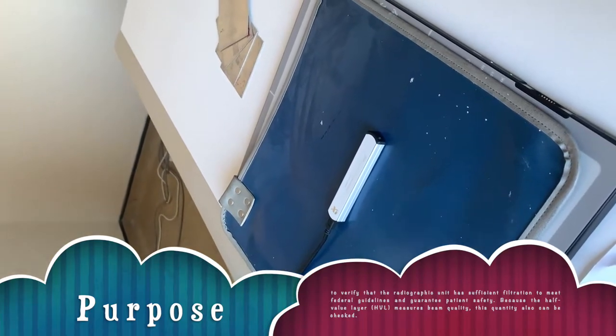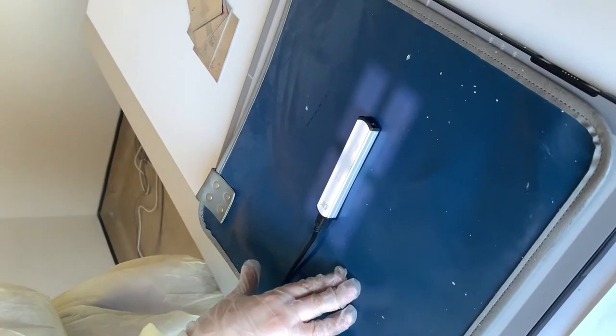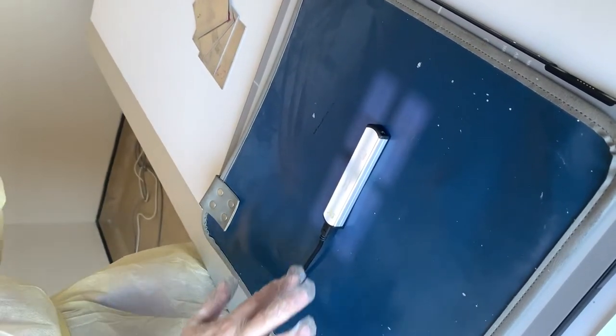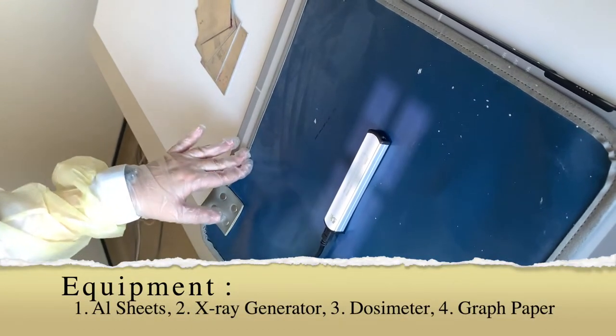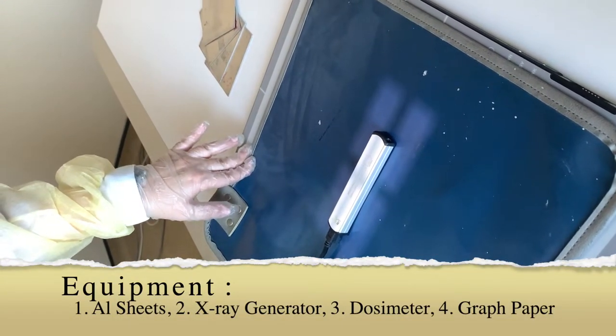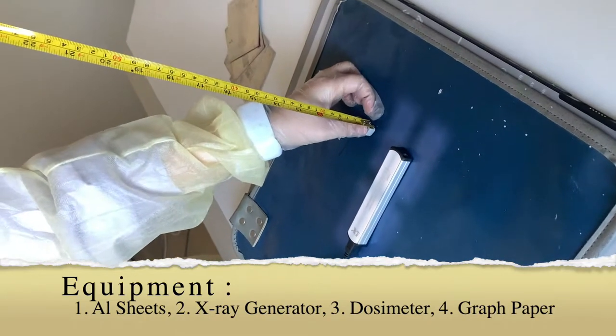For the setup of the machine, we set up the dosimeter in the middle of the IR, collimate slightly larger than the dosimeter. We place the lead sheet under the dosimeter to prevent backscatter, and then we measure the distance at 40 inches.